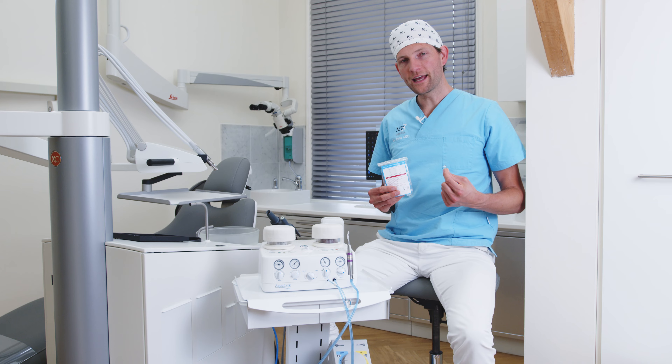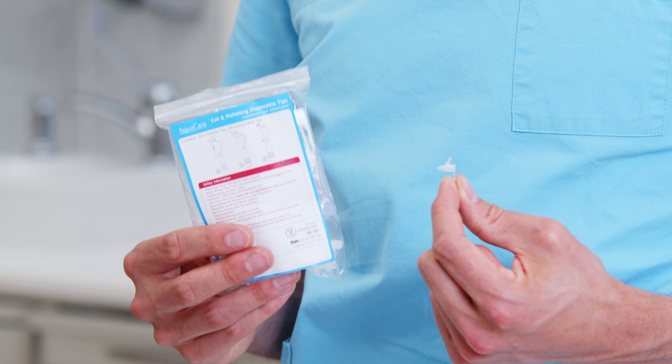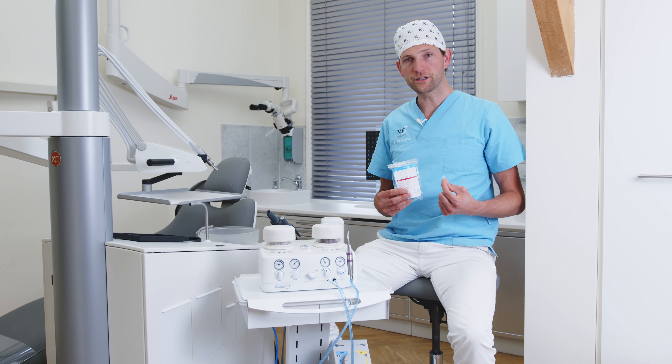Let's talk about the tips. Here we have the normal cutting and polishing tip for the AquaCare. It's used for all different powders — it can be used for aluminum oxide, but also for sodium bicarbonate or the silk powder.